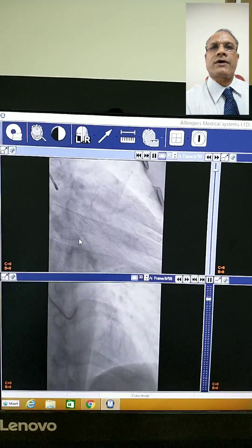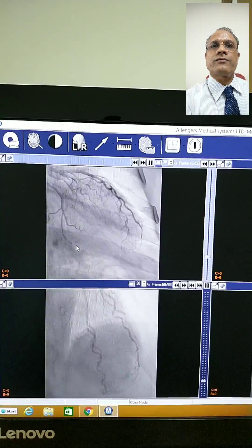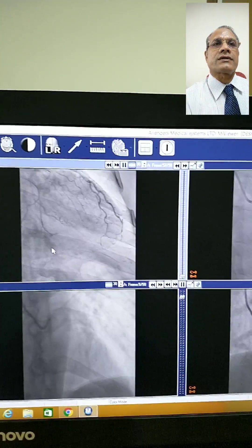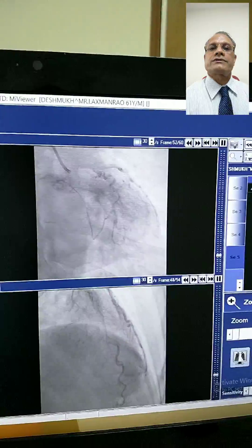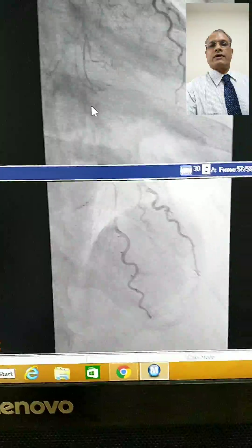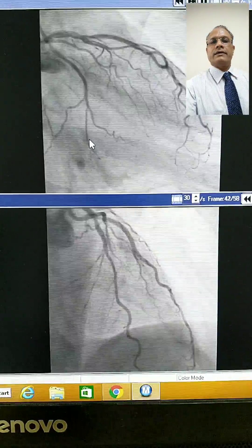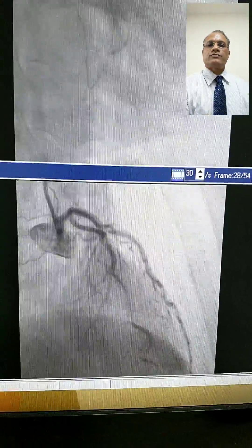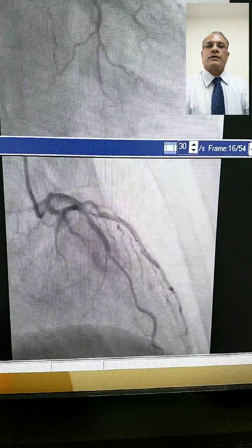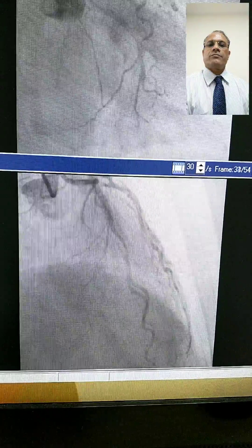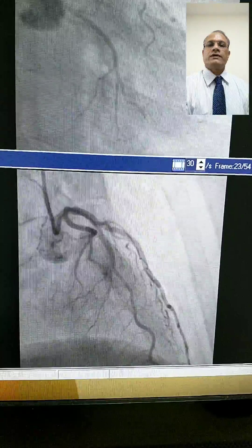As you see here, the angiography — the LAO first view shows that LAD gets narrowed at mid-junction. In the second view it is not very clearly seen, but in the third view you can see very clearly how LAD gets narrowed with each systolic heartbeat. You can make it out that LAD gets compressed in mid-LAD portion with each systolic beat.